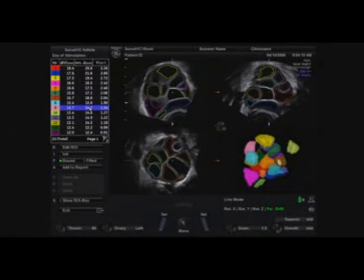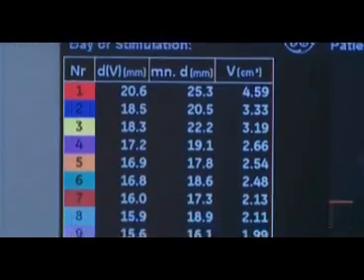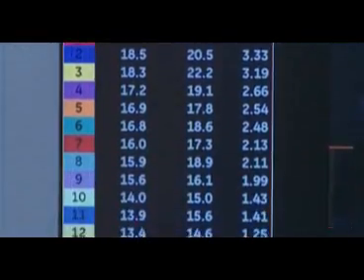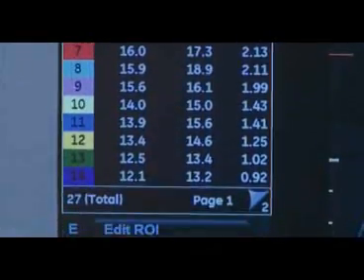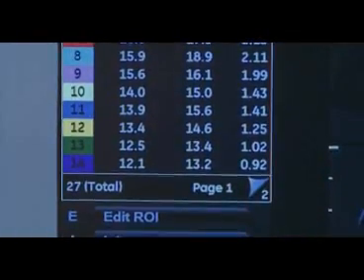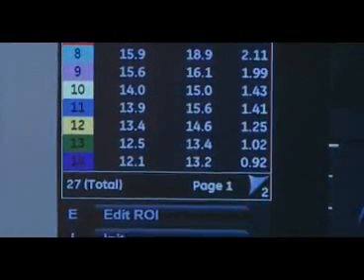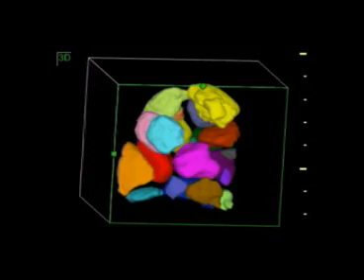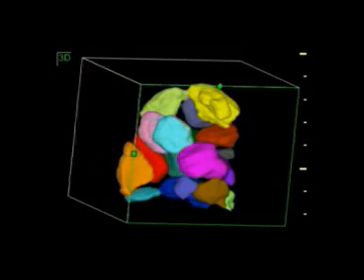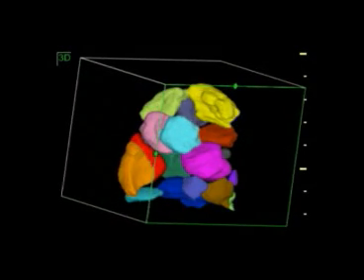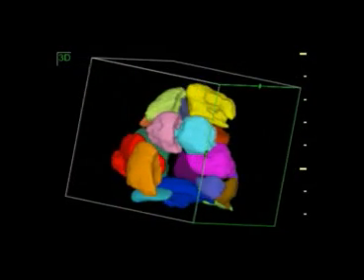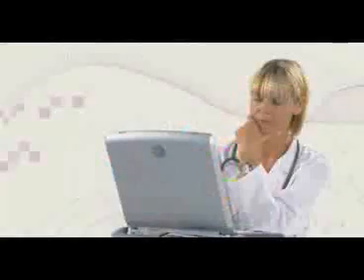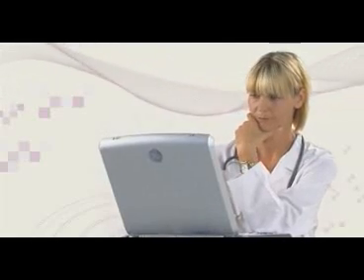SONO AVC Follicle allows you to automatically count and measure stimulated follicles. The automatic visual display of follicle measurements are arranged by size and color, enabling you to review diagnostic results at a glance.